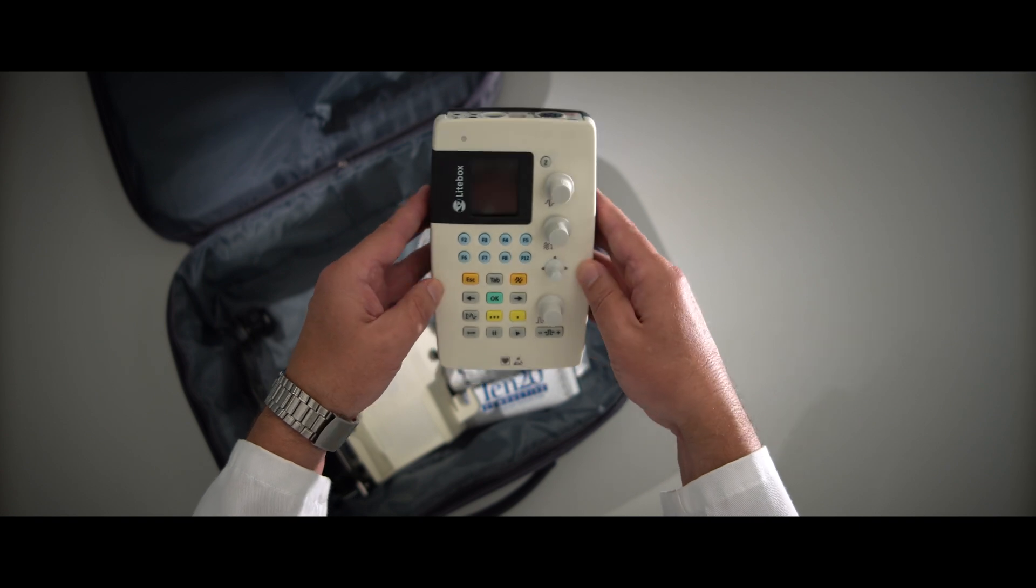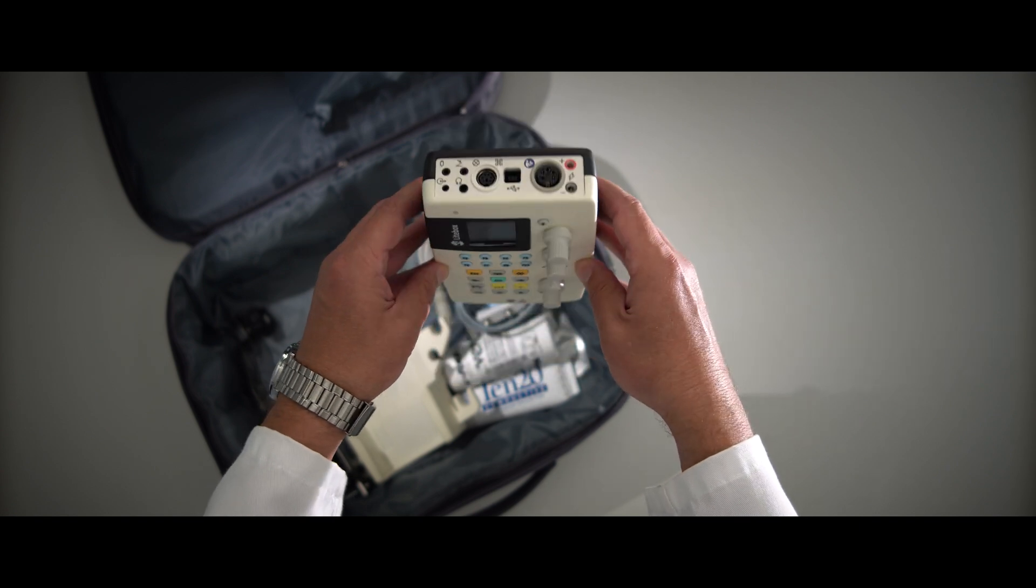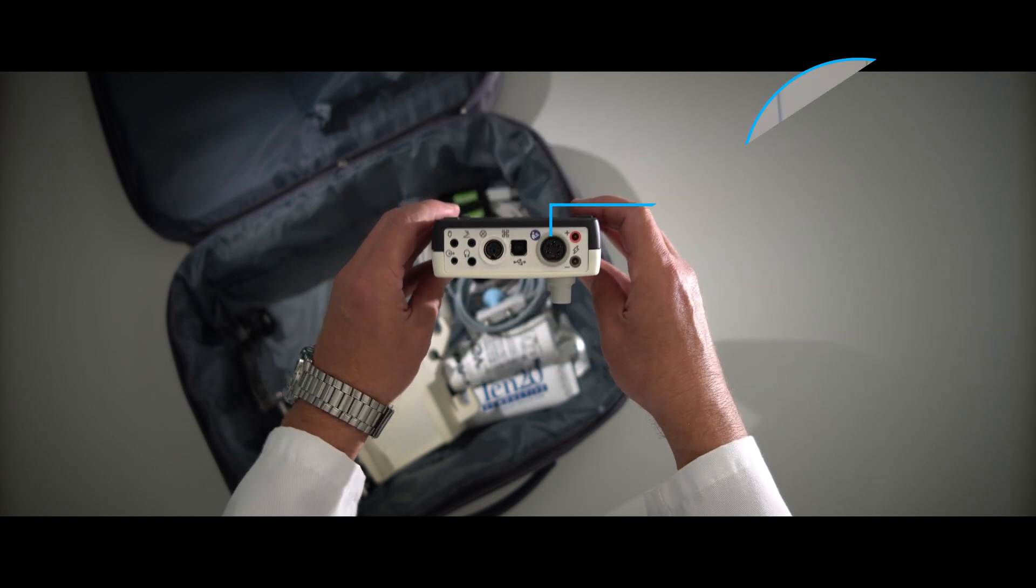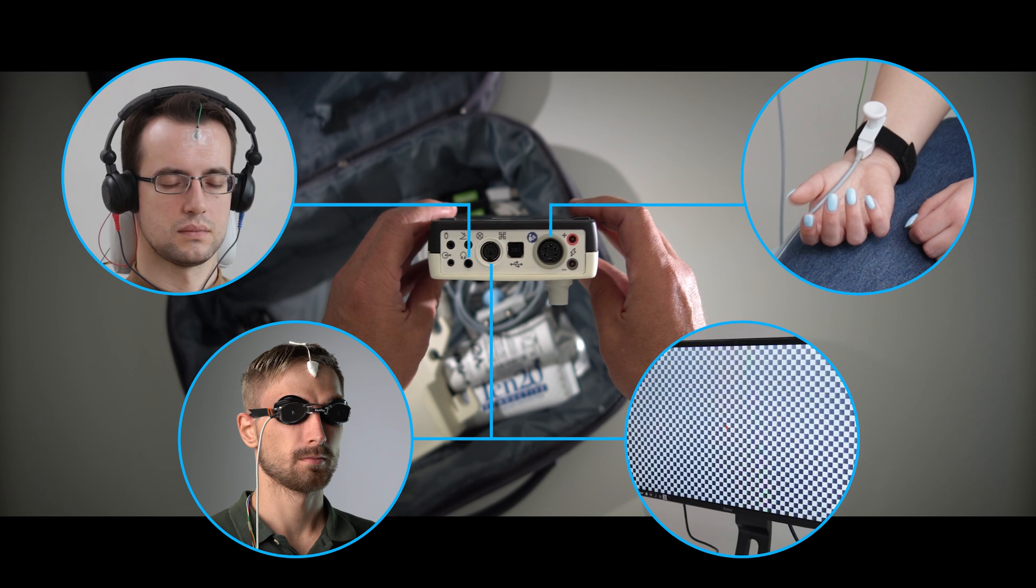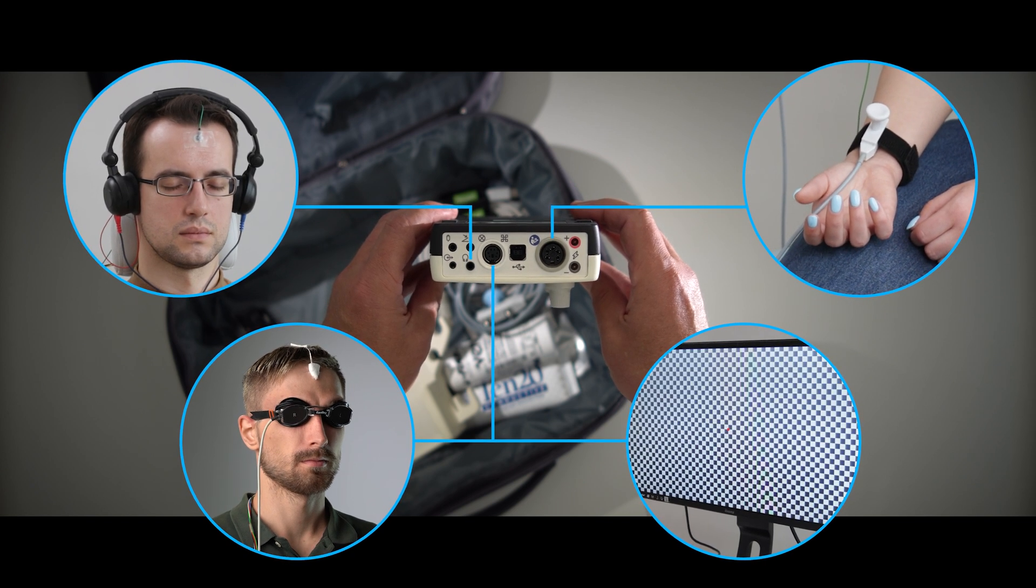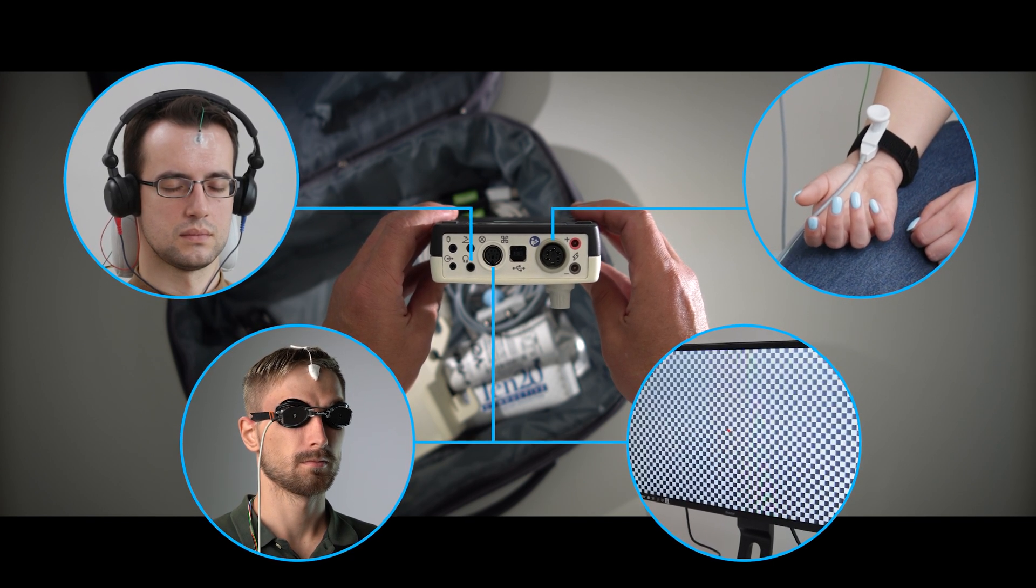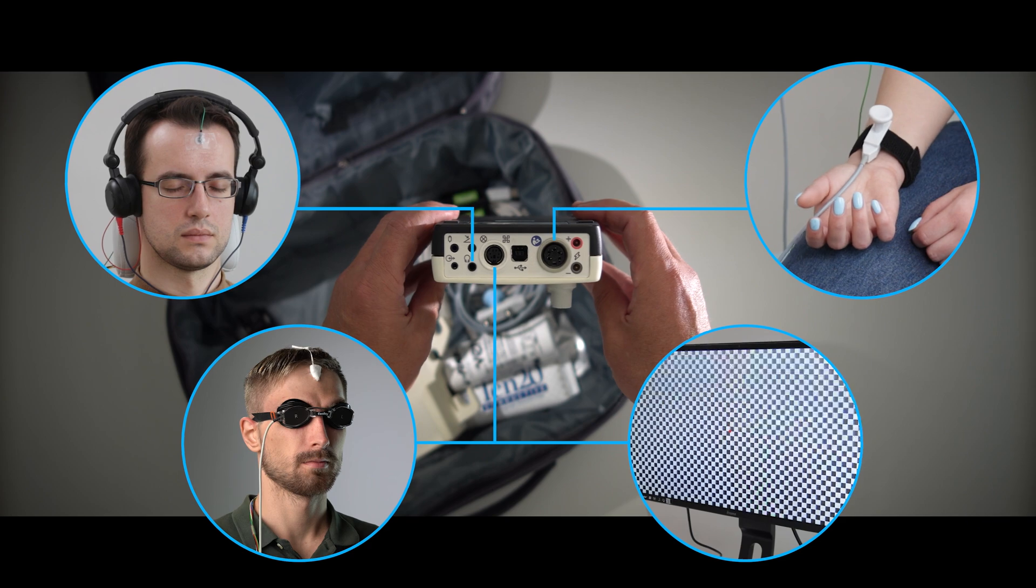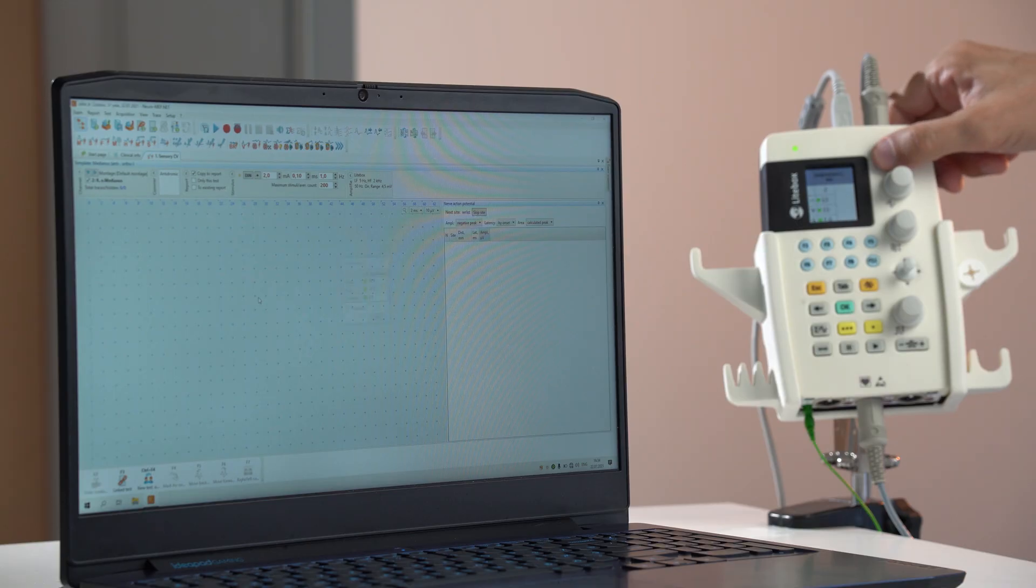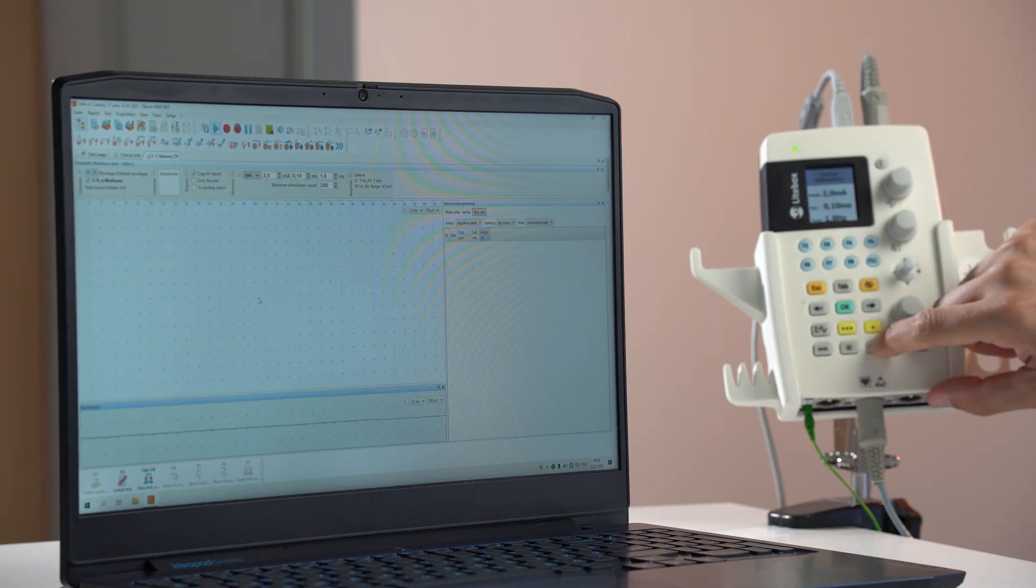Auditory, visual and pattern stimulators incorporated in the compact electronic unit are accomplished with the electrical stimulator, which can produce both unipolar and bipolar waveforms.